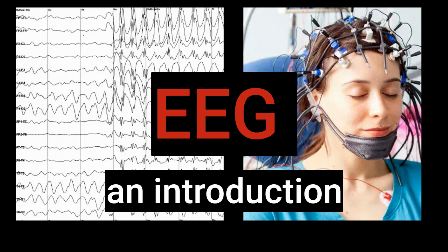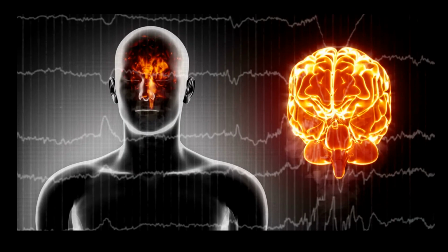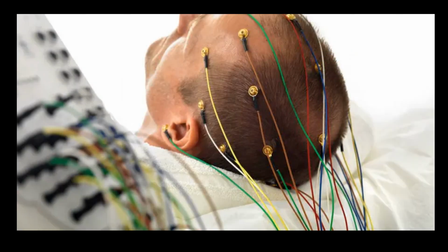Oh, absolutely fascinating. Because it gives us this direct look, this window into what's happening, into the electrical activity in our brains. So an EEG, an electroencephalogram, measures the electrical signals in our brain. Right, the tiny electrical currents that are generated by all of our brain cells. Okay, so how does that actually work? They use electrodes, they place them on the scalp, and they can detect these tiny currents. Okay, so it's painless. Completely painless, non-invasive. They're not going into your brain or anything. No, nothing like that. Just on the surface.